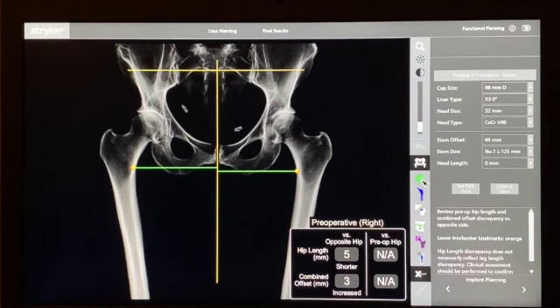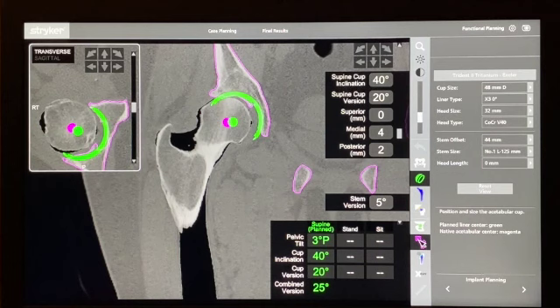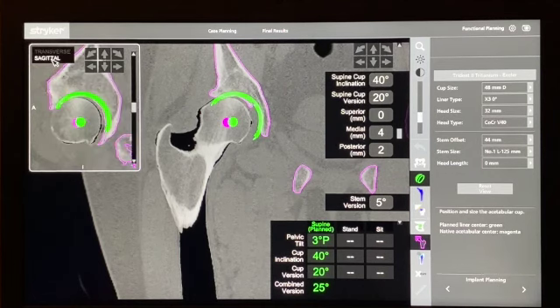I normally start by looking at the acetabulum and go to the CT view. We have a coronal view, a transverse view, and a sagittal view all available. The purple represents the bony landmarks and the green is the component. The two dots show the green as the centre of rotation of the acetabular component versus the purple, which is the centre of rotation of the femoral head as it stands at the moment.